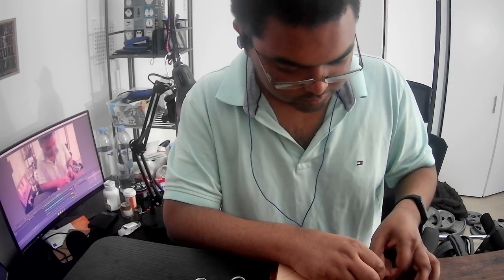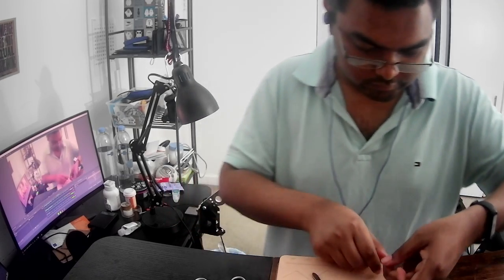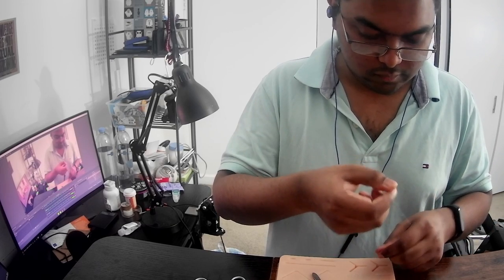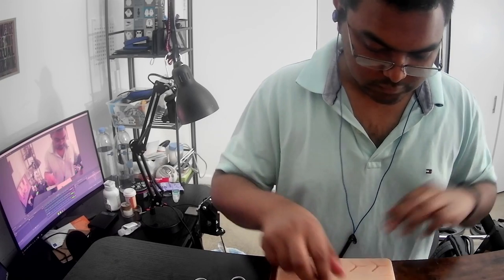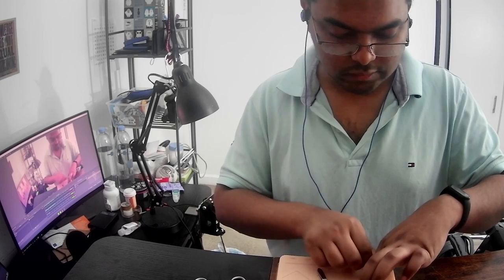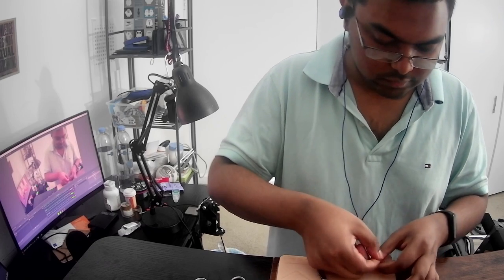I got two down, two out of 12 untangled. Okay, let's try the sutures. I guess in real life, once you're done using a little bit, you snip it, right? And then there are some sutures which automatically decompose, so you don't need to visit your physician again. Oh, no. Okay, I was pulling the wrong side.